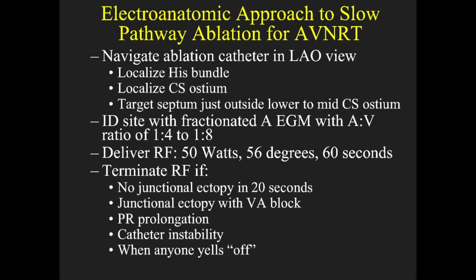And I'll stop RF if there's no junctional ectopy in 20 seconds. If there's junctional ectopy with VA block, obviously. If you get PR prolongation, which would be rare without junctional ectopy. If there's instability of the catheter, or if anybody in the whole room or the whole hospital yells off, if I hear that, then everybody has authority to turn off the RF power. I'd rather come off and go back on.